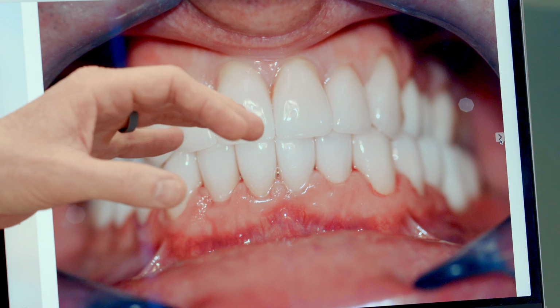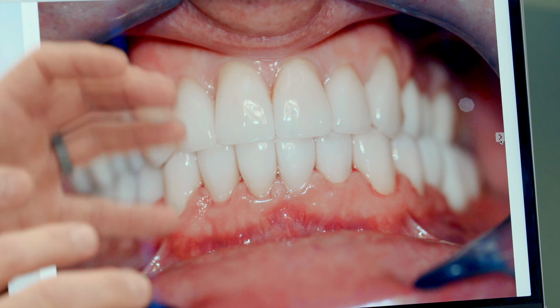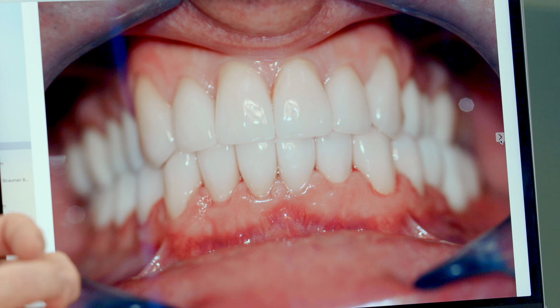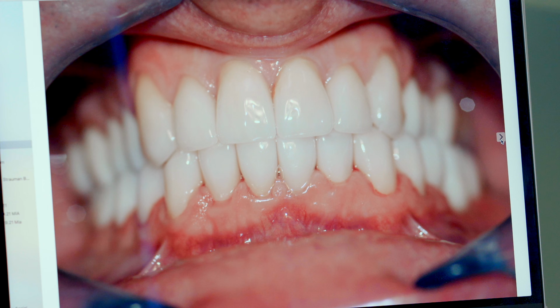And we've taken the pressure off of these front teeth, which is, once I was able to do that, I felt a lot better about maintaining those teeth because the load is off of it. So I know that they're going to last this patient for the rest of their life. And by restoring the harmony, by giving them balance on both sides of the jaw so that when they chew, there's good balance and support on both sides.